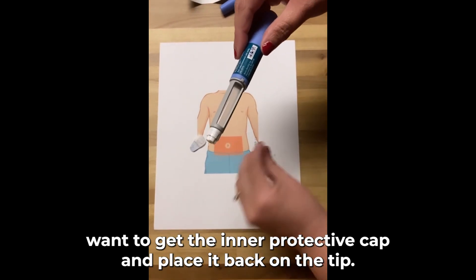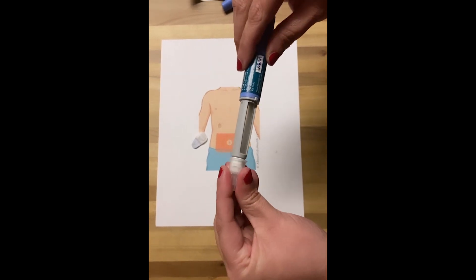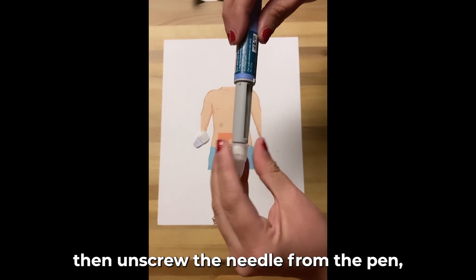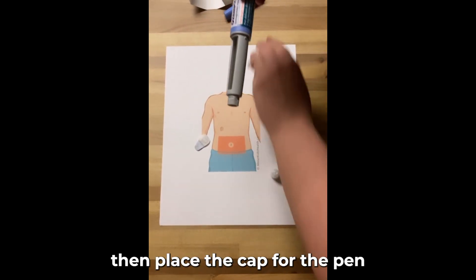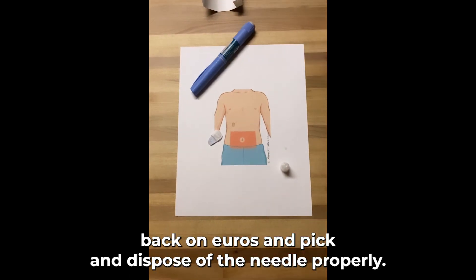Then you'll want to get the inner protective cap and place it back on the tip. Put the outer protective cap on the pen, then unscrew the needle from the pen. Then place the cap for the pen back on your Ozempic and dispose of the needle properly.